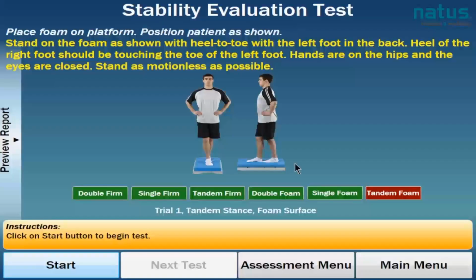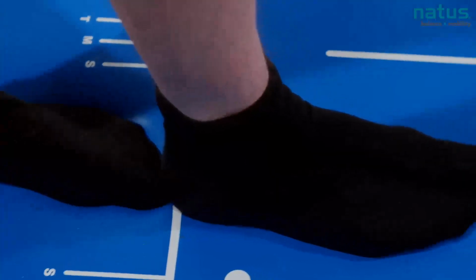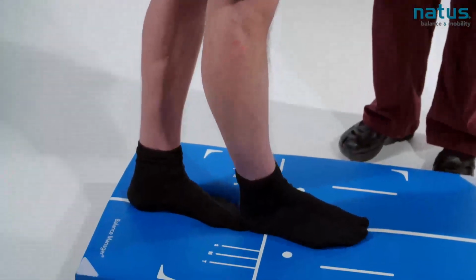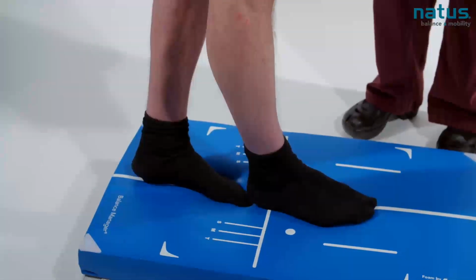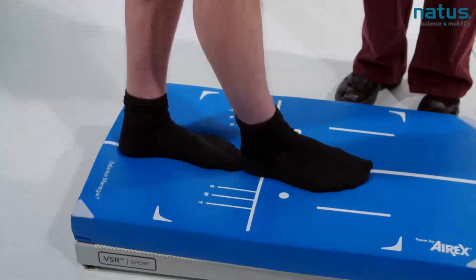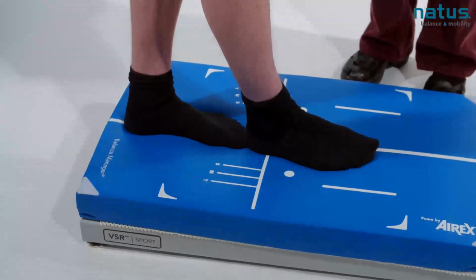The last trial in the SET protocol is tandem stance on the foam. I'd like you to stand one foot directly in front of the other, left foot or the non-dominant foot behind, hands on hips. How you doing? You good? I'm going to have you stand as motionless as possible. We're going to do a practice first.